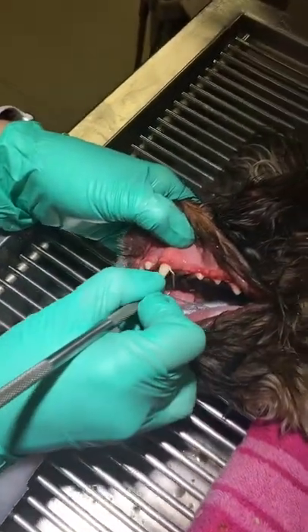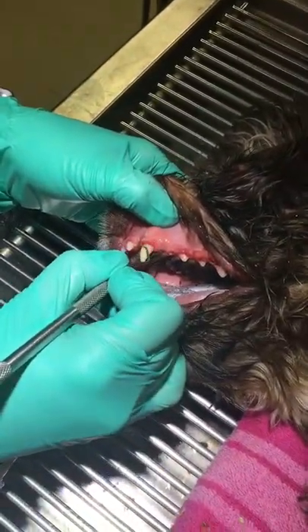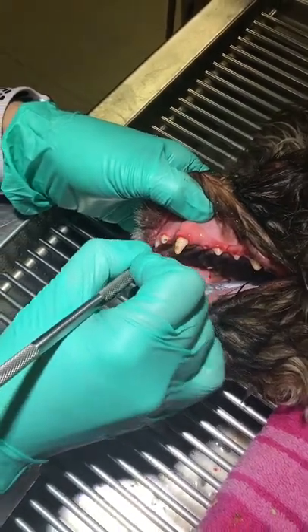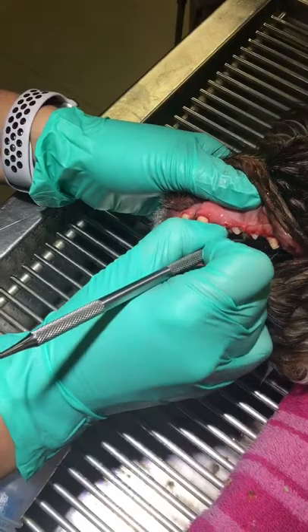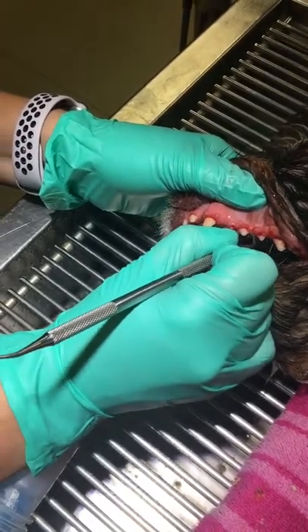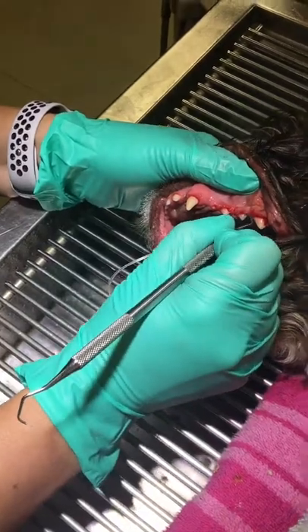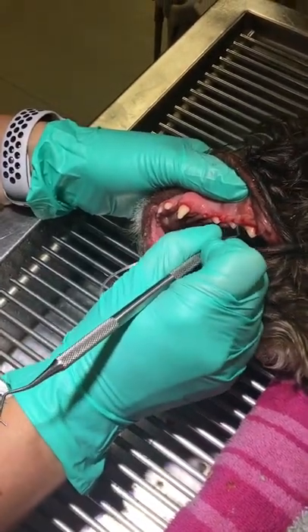For subgingival cleaning, a curette can be used. A curette has a sharp working side edge and a rounded tip. Insert gently into the pocket until resistance is felt and tilt the curette away from the tooth to engage the sharp edge against the root surface. Then pull firmly out of the pocket.